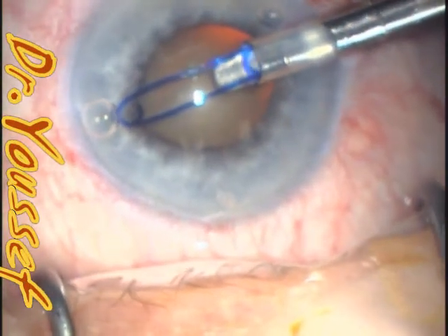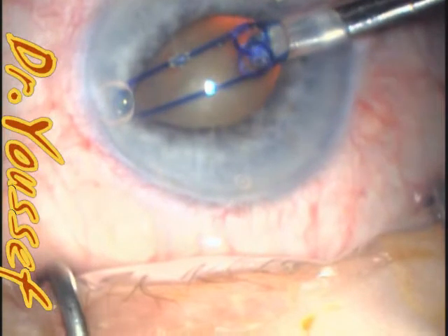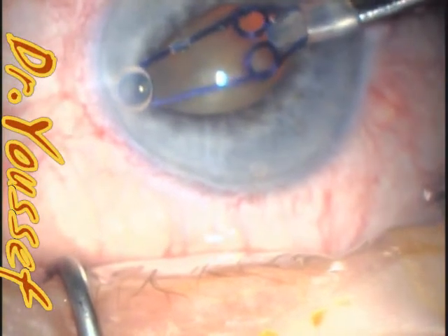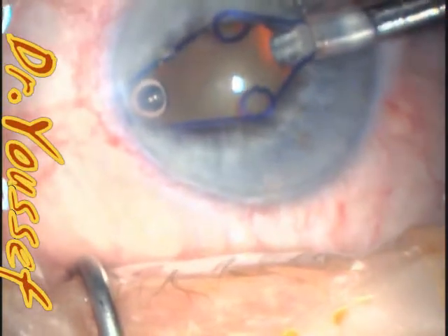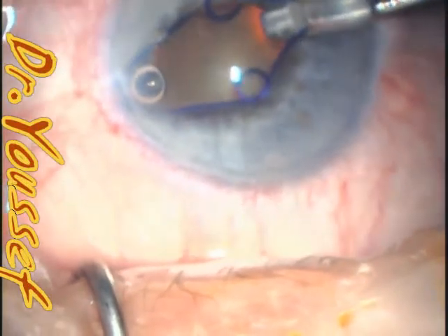I engage the nasal part first and I would rotate the injector slightly superiorly and posteriorly to engage the upper one.